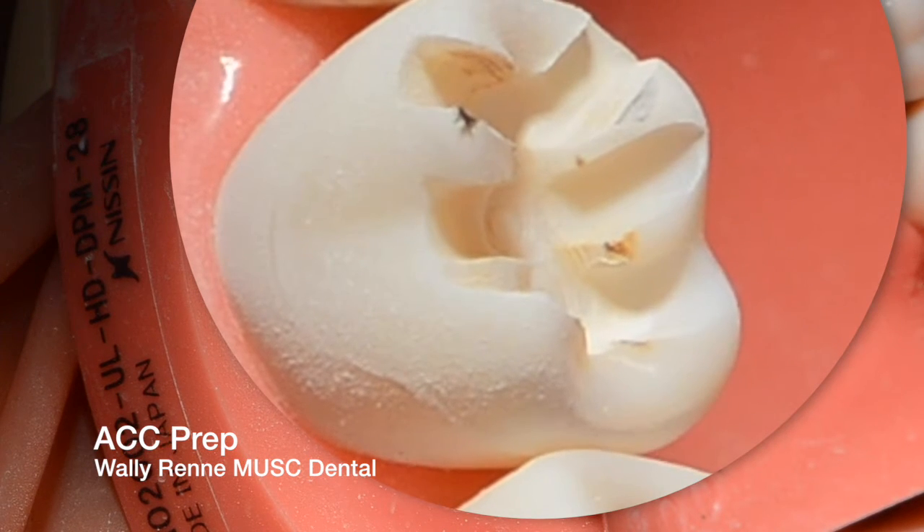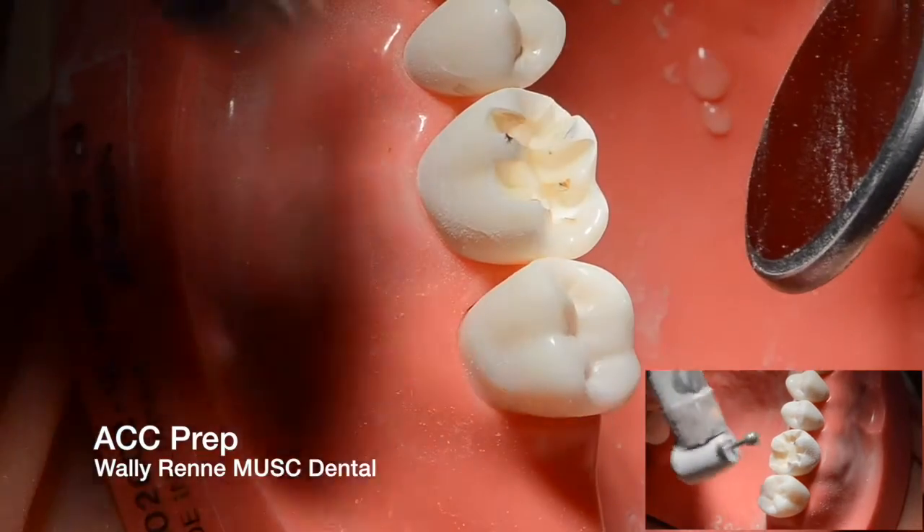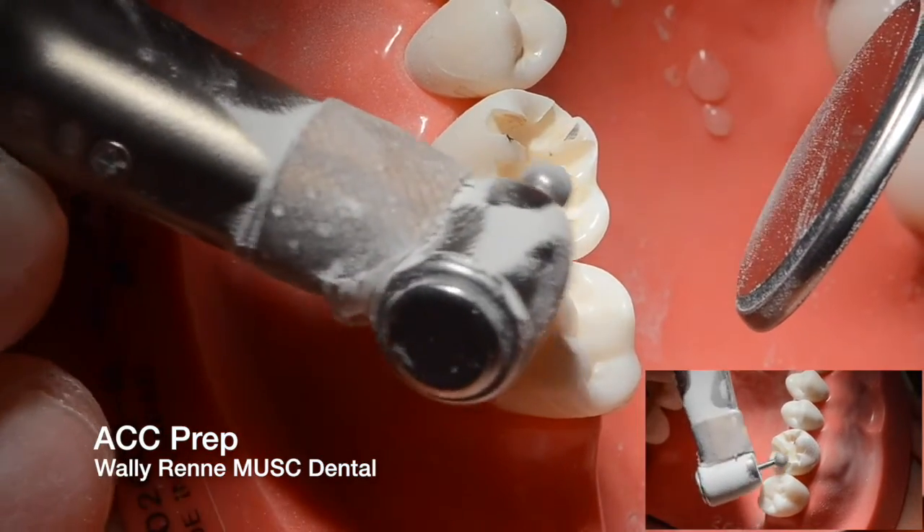It should look kind of messy when you're done with this — it's not supposed to be pretty. Then you need to smooth them. You could use a giant round diamond for speed.